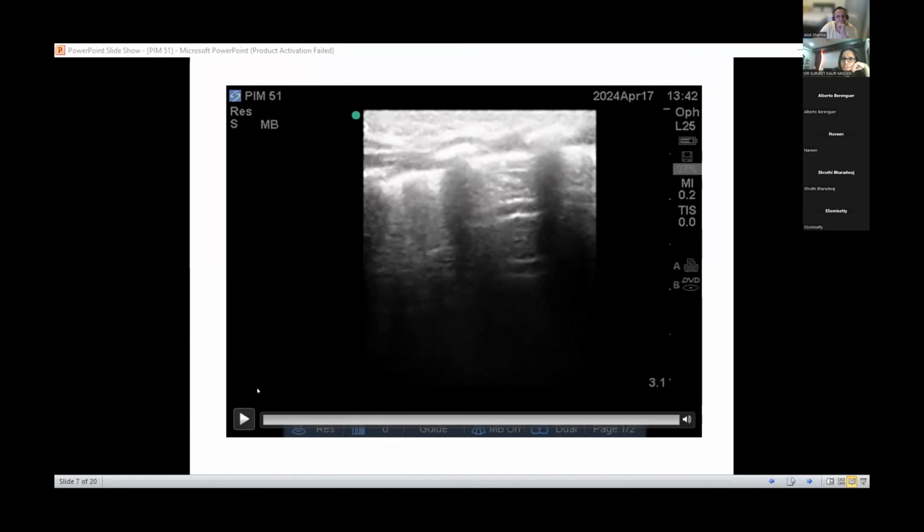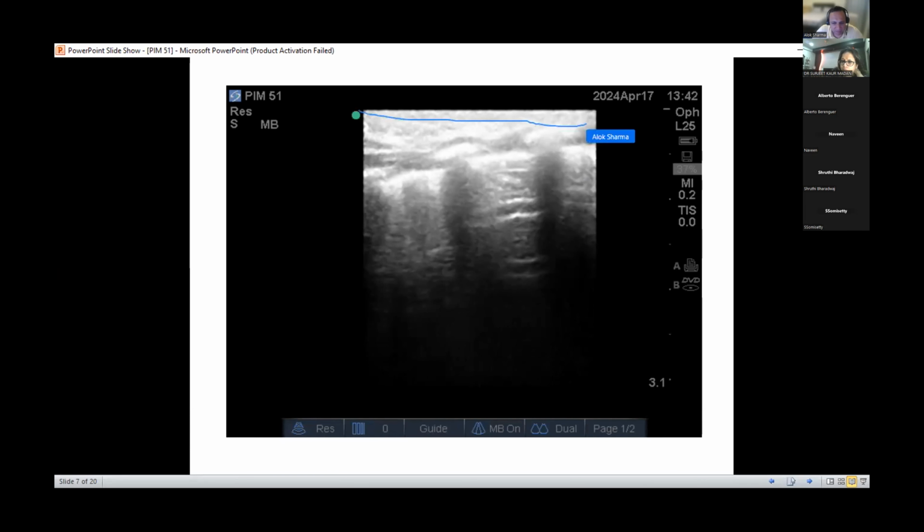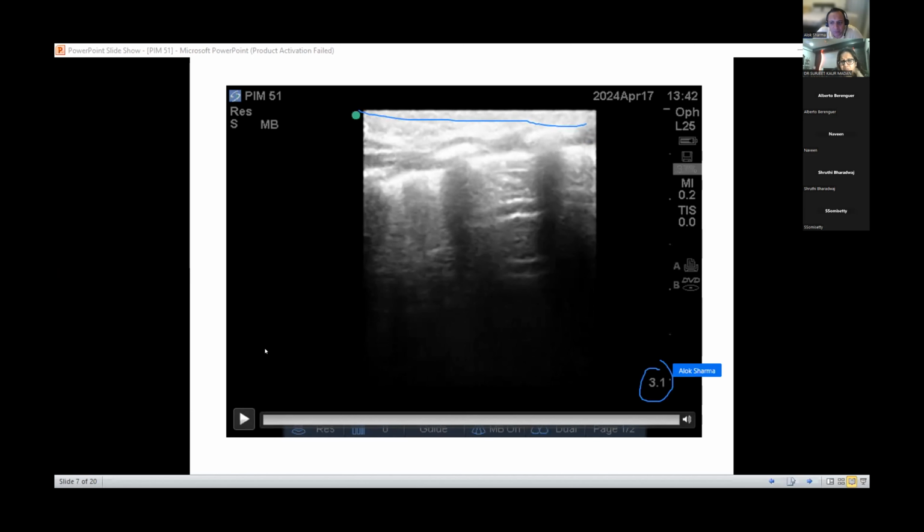Any thoughts about gain settings? I think we are losing the depth here, only up to 3.1 centimeters. Surjit, the images are great. The only comment I have is you've got very high gain settings. What frequency are we using? I'm not sure about the frequency on my machine, or how to adjust it. I was asking you even last time. Maybe if you're planning to do it this weekend, I'm free. We can arrange a call and have a look at it.